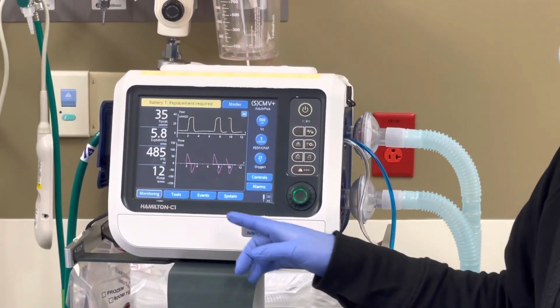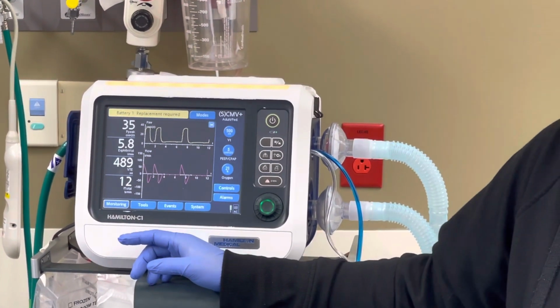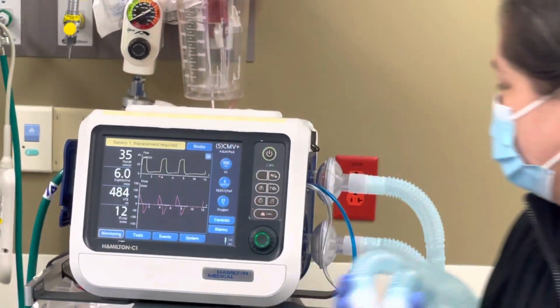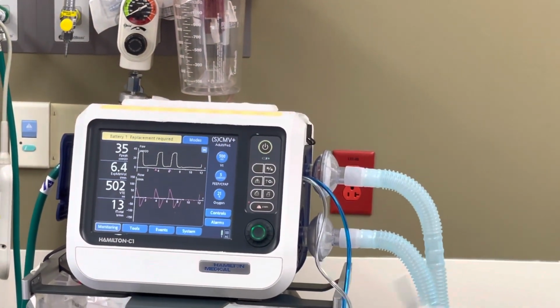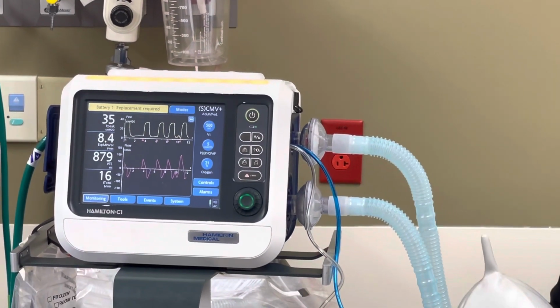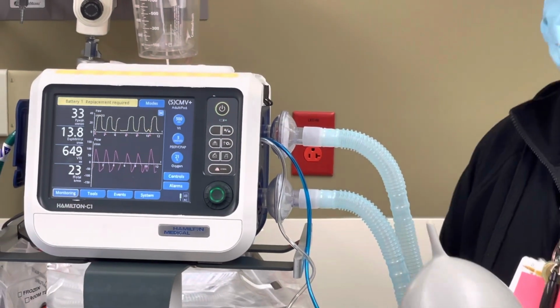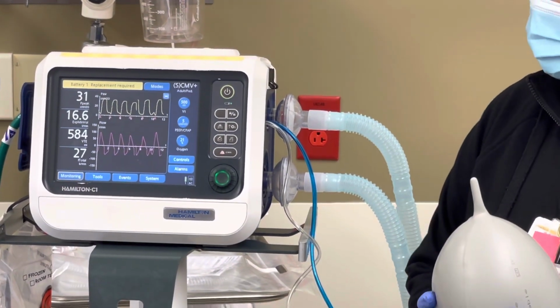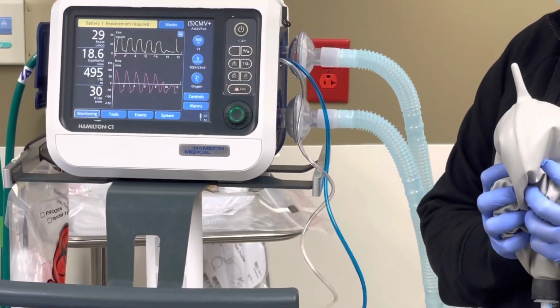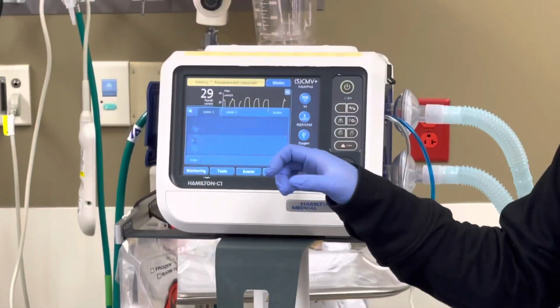And let's see, so any questions on any of that? Okay, so if my patient was to be breathing more, you are gonna see it'll go a little bit more. So basically you're gonna be set to 12 and you're gonna be breathing whatever it is. If my peak pressure starts to go up and it's gonna hit my alarms, hit the alarm, I might have to lower it a little bit.